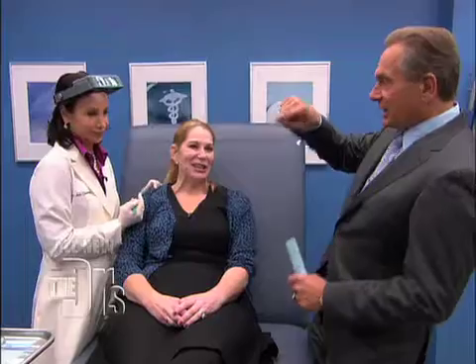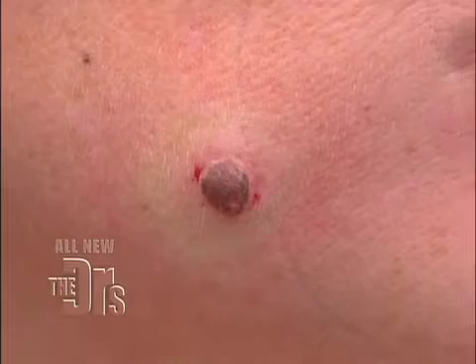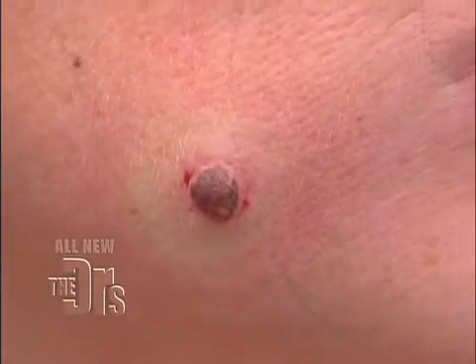A couple techniques — we can do an elliptical excision or a shave. Advantages and disadvantages to both, but we examine and concur: let's shave it off. In this case, we're going to remove the mole in the same plane as the skin, so it will heal absolutely flat. If you were to cut it out and stitch it, sometimes there's a higher risk of a scar forming.